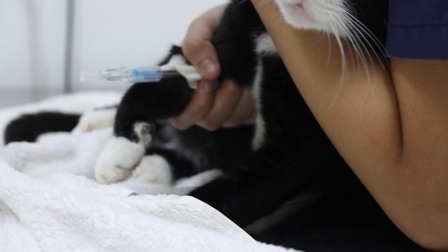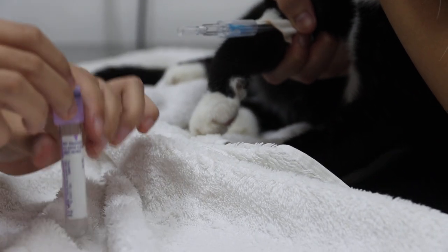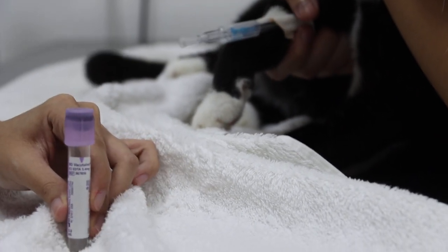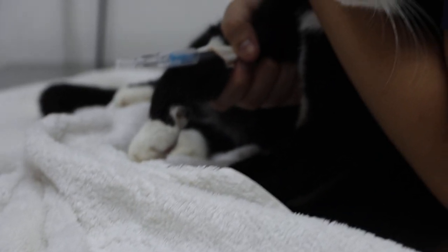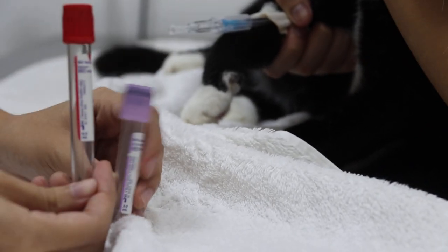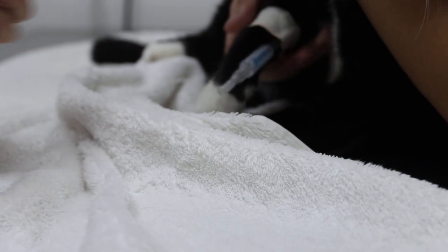Put the blood into the tube with EDTA so the blood will not clot. There are two tubes on the table — one is EDTA and the other is a plain tube where the blood will clot. Put about 2 to 3 ml into each.